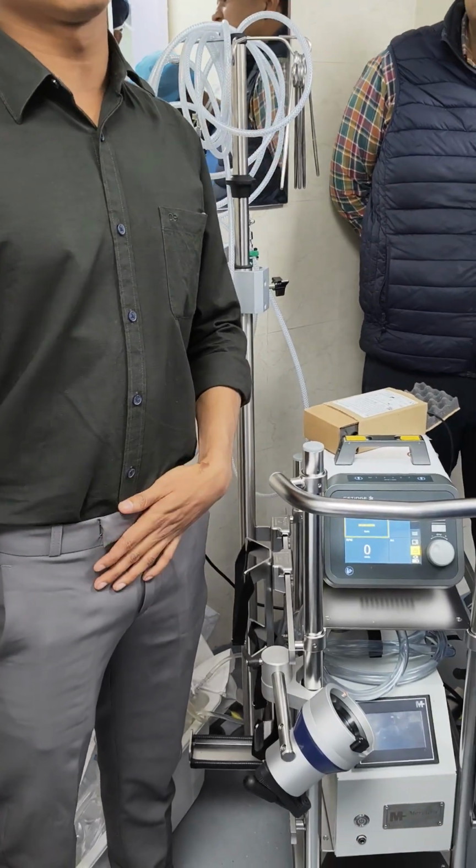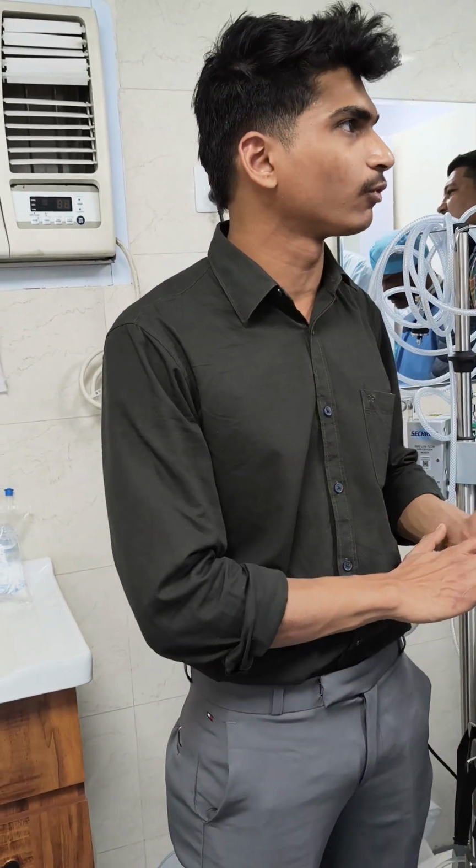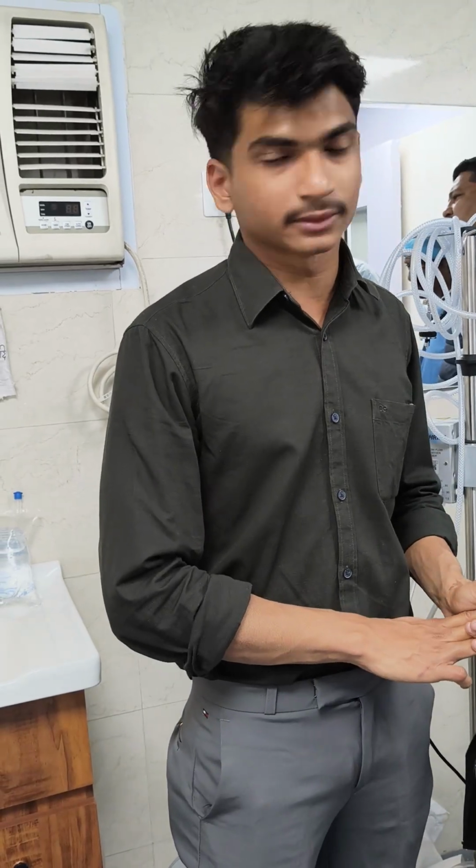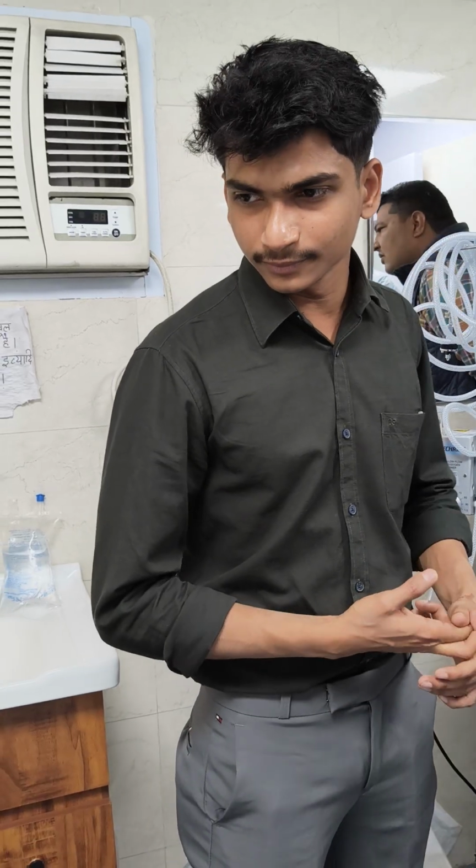No, it is better to start with 1500. That is mentioned here, like zero flow. और वो बेस वाला सेट भी करते हैं 1500 आरपीएम का ही। नहीं, 1500 आरपीएम पे जैसे हमने इसको सेट कर दिया.